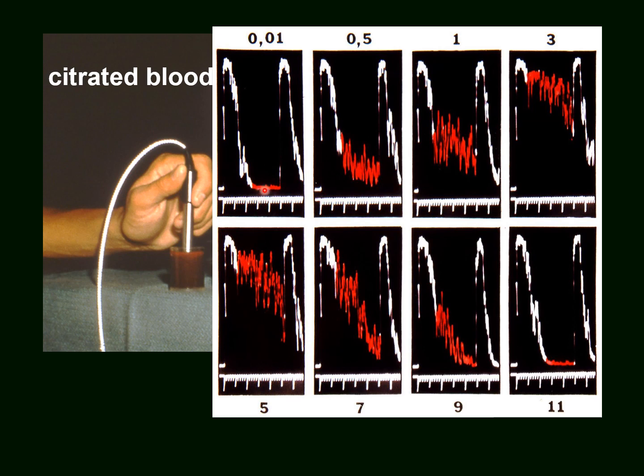And you can see that at low cell count or at very high cell count, low or no amount of sodium citrate, almost all sodium citrate, the reflectivity is low. It increases with the cell count and then decreases.